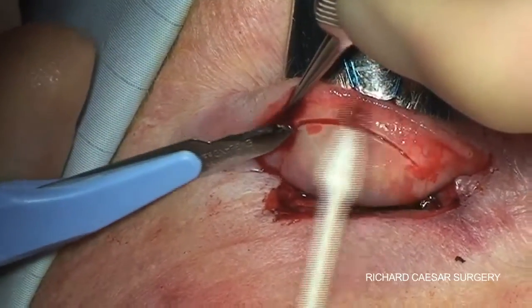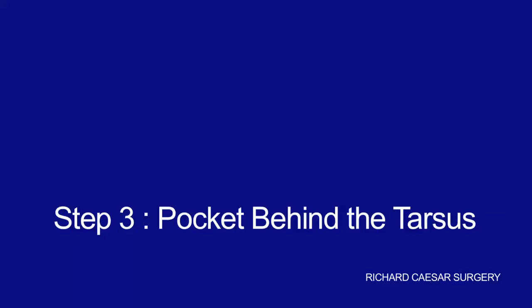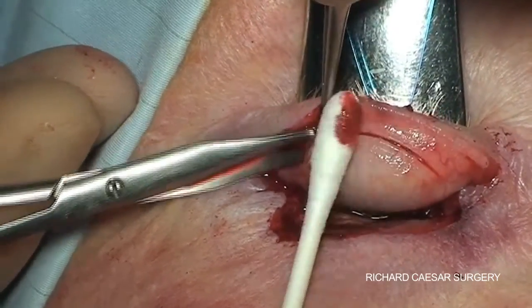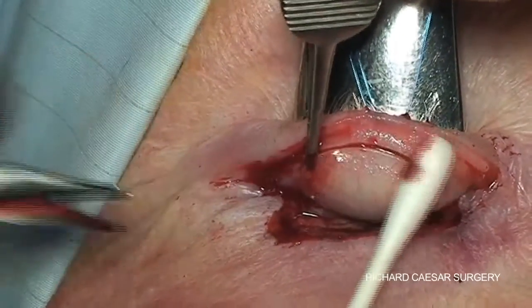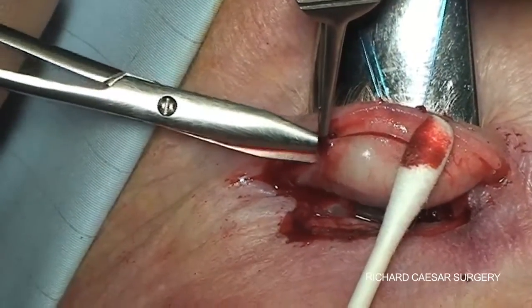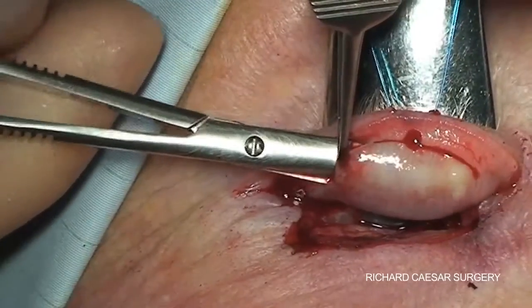The reason for this is the next step. To make life easy, you want to pocket from one side to the other behind the tarsal plate, hugging its surface. Once you have hold of the tarsus with the St. Martin's forceps, the spring scissors with the tip pressed against the tarsus can go from one side to the other.